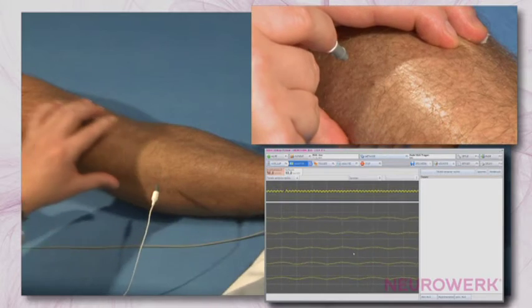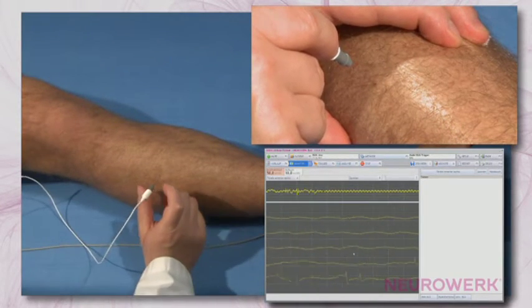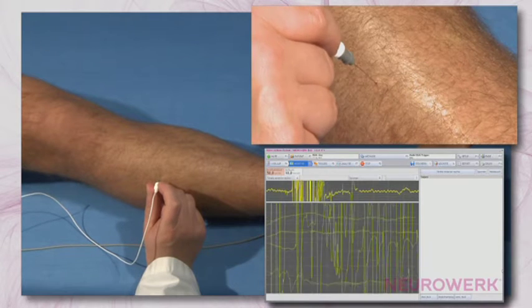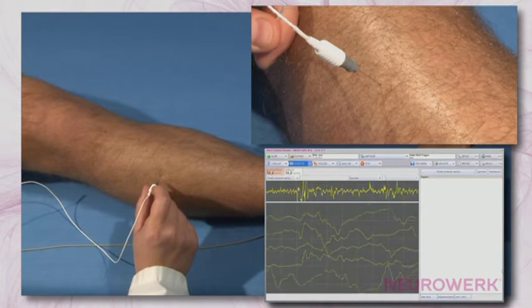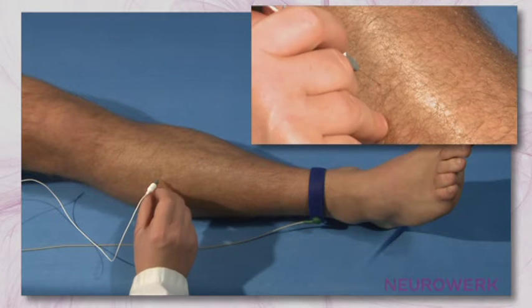The insertion of the needle inside the muscle happens rapidly and perpendicular to the skin into the superficial muscle layers. The needle position is changed on various occasions to enable the search for spontaneous activity by fan-shaped pricking. These movements cause the so-called insertion activity. This is a showering electrical activity that lasts less than 1 second.